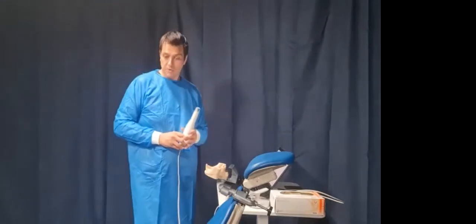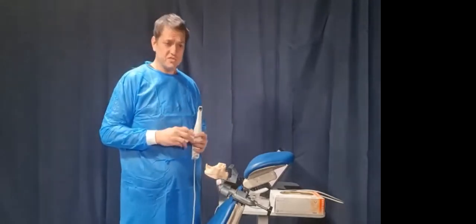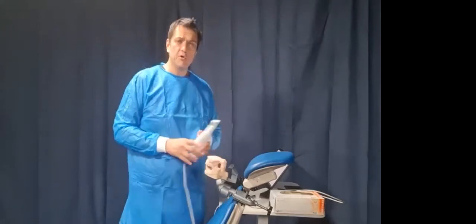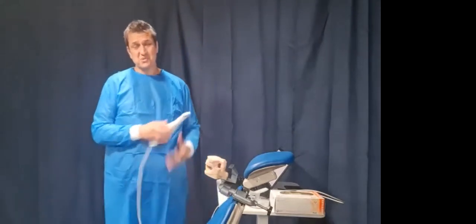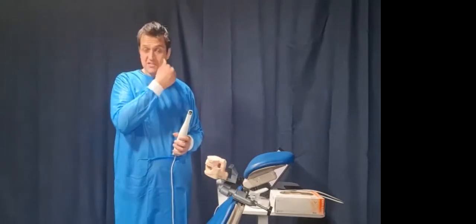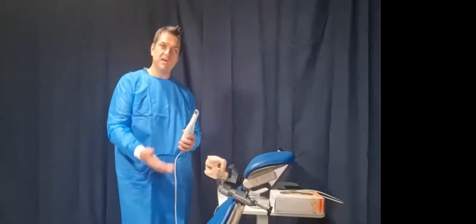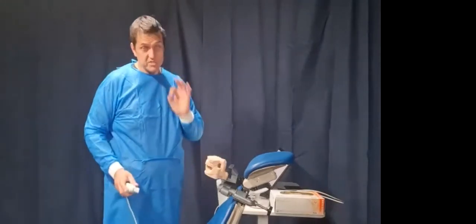So let's pop the head on and let's see how we're going to record this occlusion. Now this occlusion is only one tooth. When you've only got one tooth, two is good, because you've basically got 100% more than if you had one. But we've subtracted an entire 100% of tooth-to-tooth contact, proprioceptive contact points. In this case, we've only got one. But the principles stay the same.